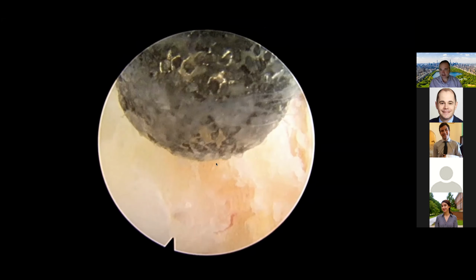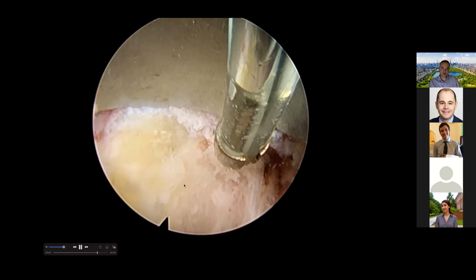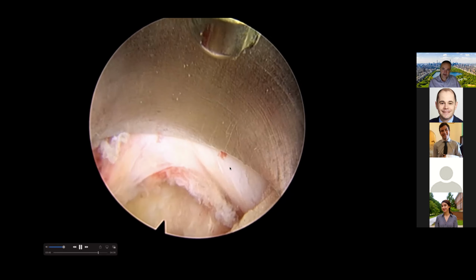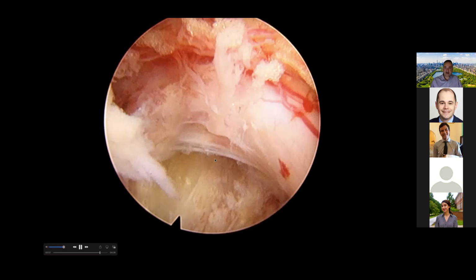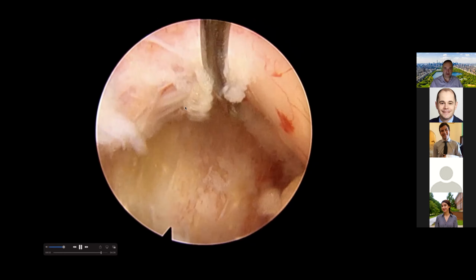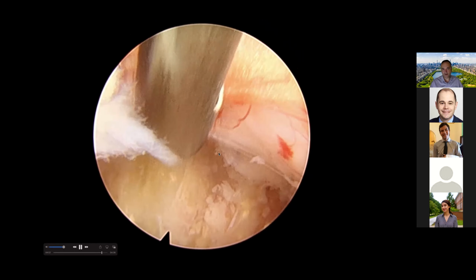So calcified disc is like bone, okay? So we remove that, and now you see the nerve. There's nothing there pushing on the nerve, because all that area was occupied by the calcified disc herniation, which was applying pressure on that nerve that was the cause of your pain. But now, as you can see here, that calcified disc is gone.